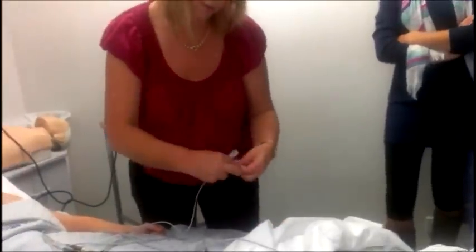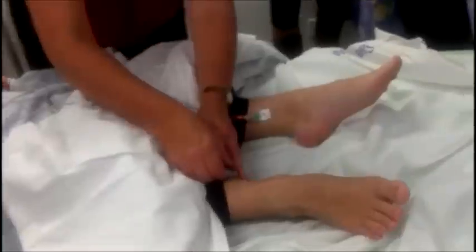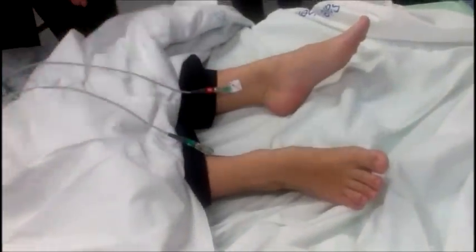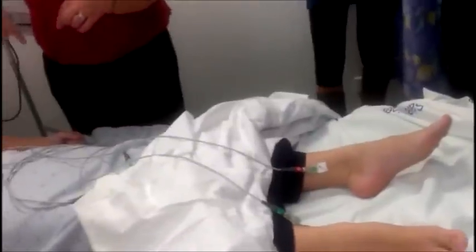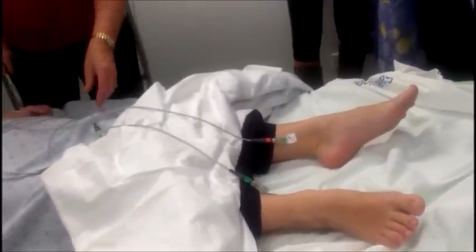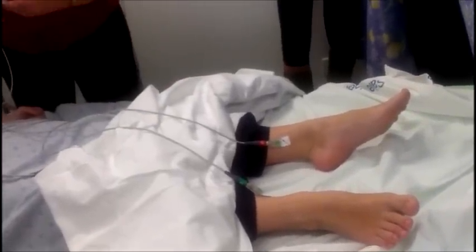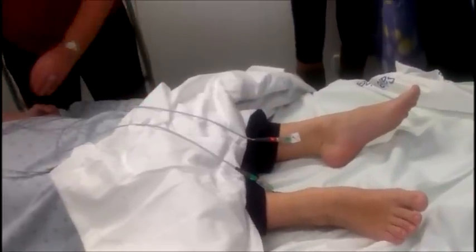Right leg. This is where sometimes if AVF is positive when it should be negative, you've put the limb leads on the wrong side — so just check that. If it's positive, check your limb placements. I know that with the doctor's OSCEs they do it deliberately to make sure that students are checking everything.